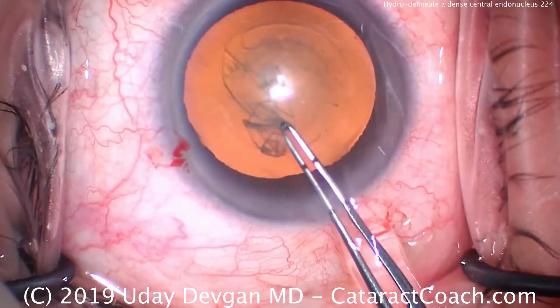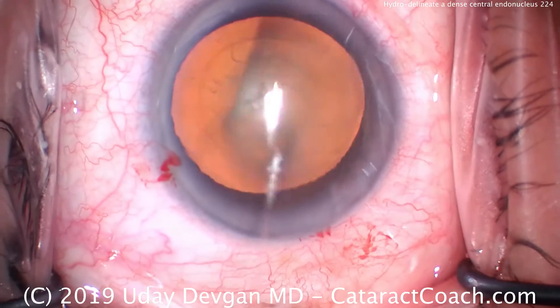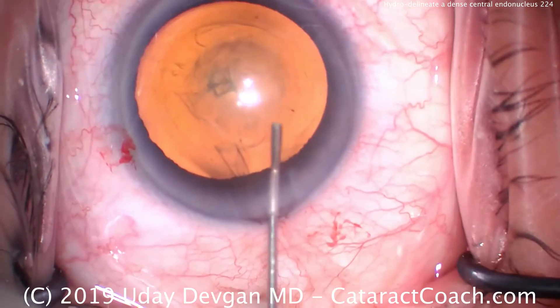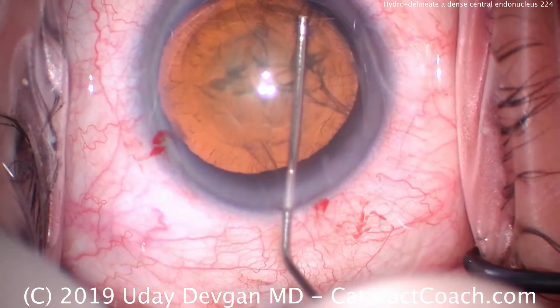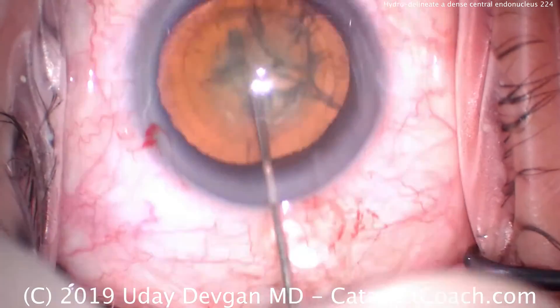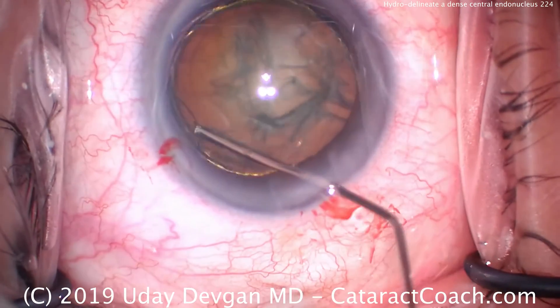The patient will get hydrodissection as well as hydrodelineation. Hydrodissection is our typical move. There's the hydrodissection — fluid waves going across the lens. And now here's the delineation coming right now — that's the golden ring of hydrodelineation.